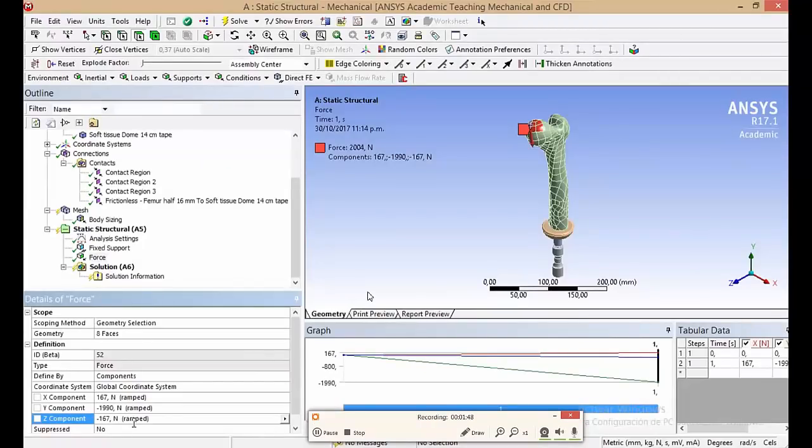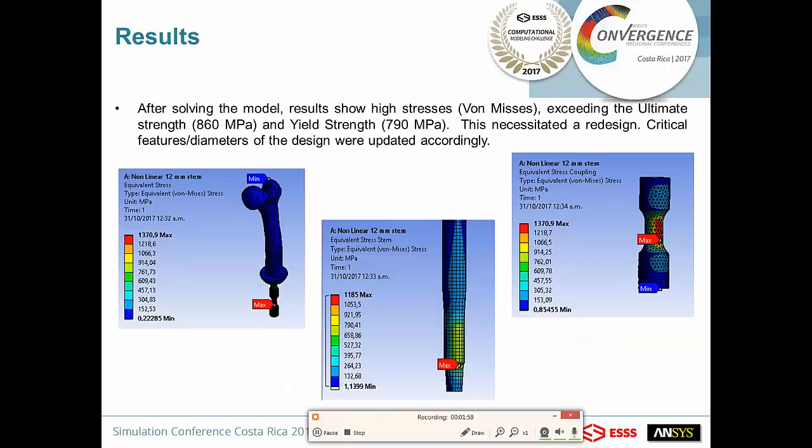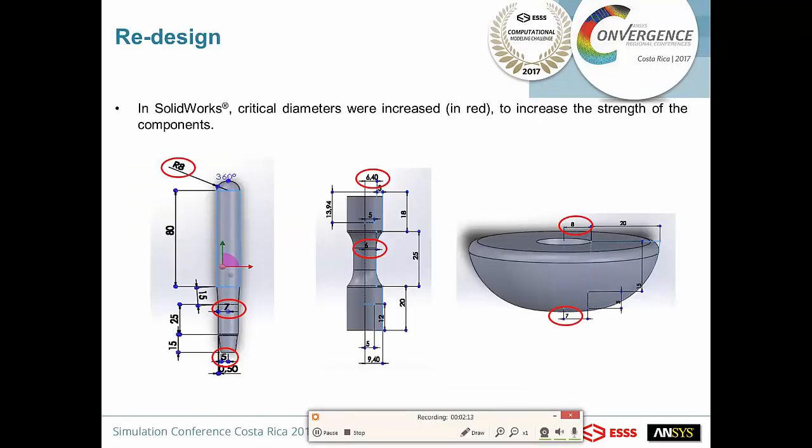So we transfer the CAD model into ANSYS. We apply the load that corresponds to the body weight into the system, and we got the following results. As we can see, we got a really high stress in the stem and in the coupler that are way higher than our limit, which is the yield strength. So what we did was to redesign, changing some diameters and increasing them in order to increase the strength of the components.